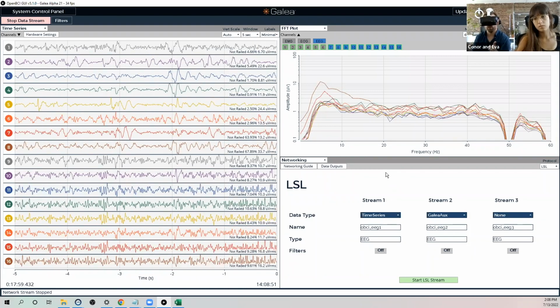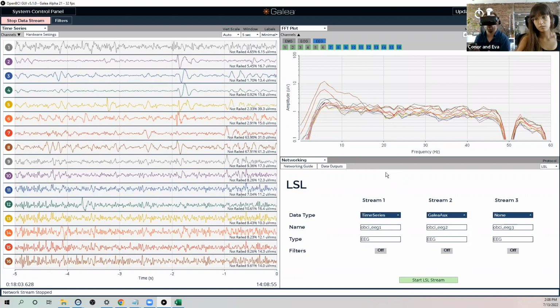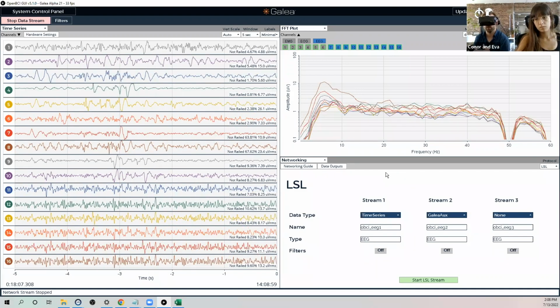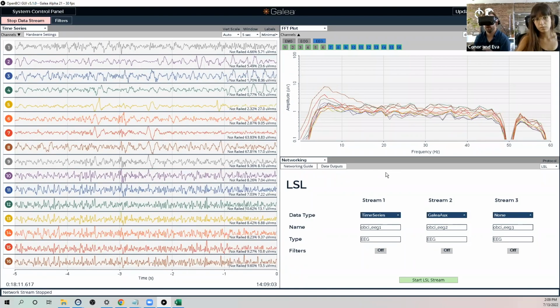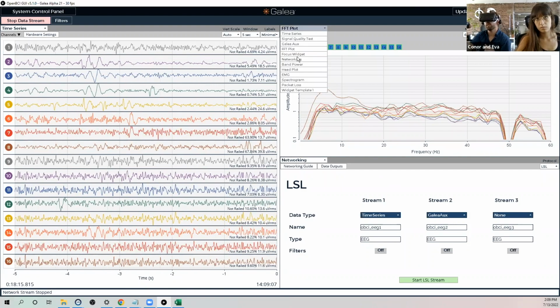We also believe that the heart rate variability, the pupillometry, a lot of the raw data that you can get out of the Galea system, when it's out there in the wild, you're going to be able to use that information in a very valuable way. A big one, the EMG data.